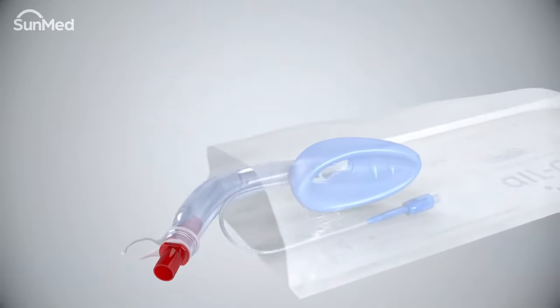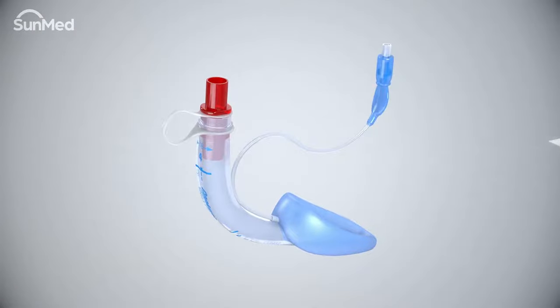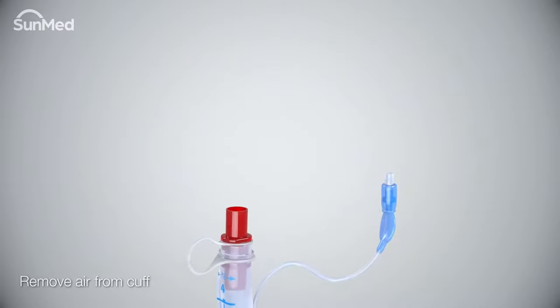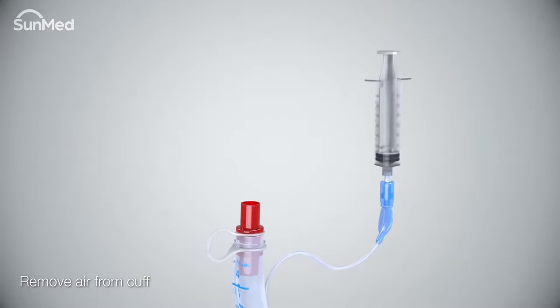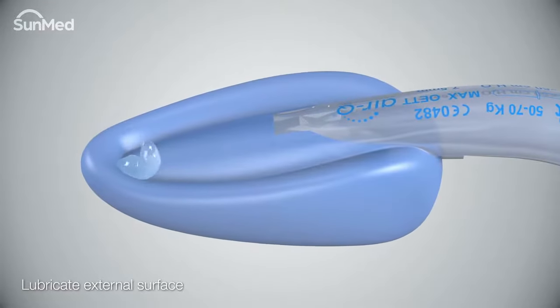Gather the equipment needed for placement of the air Q3 airway. Aseptically remove the air Q3 from the package. To prepare the air Q3 airway, use a syringe to completely deflate the cuff.